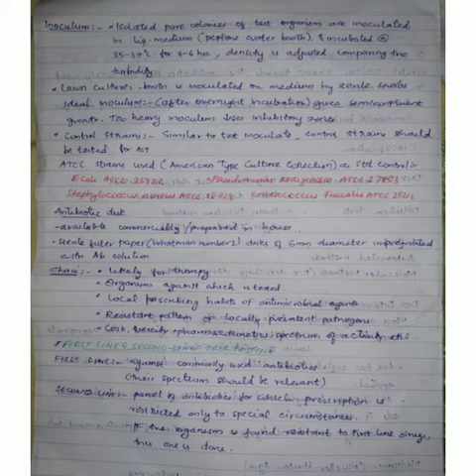Now to the antibiotic disc. Antibiotic discs are available commercially or can also be prepared in-house. Sterile Whatman No. 1 filter paper discs of 6 mm diameter impregnated with antibiotic solution are available. Now about the choice of antibiotic disc.